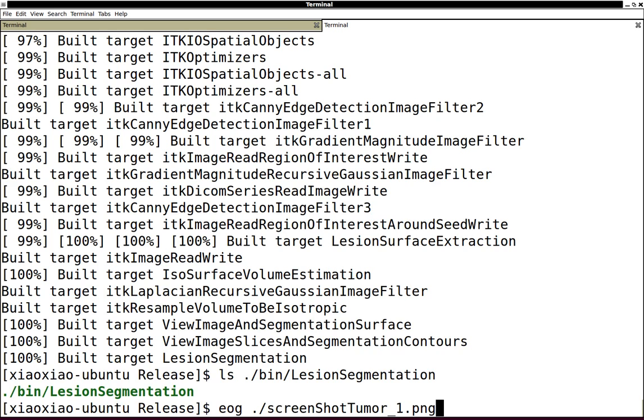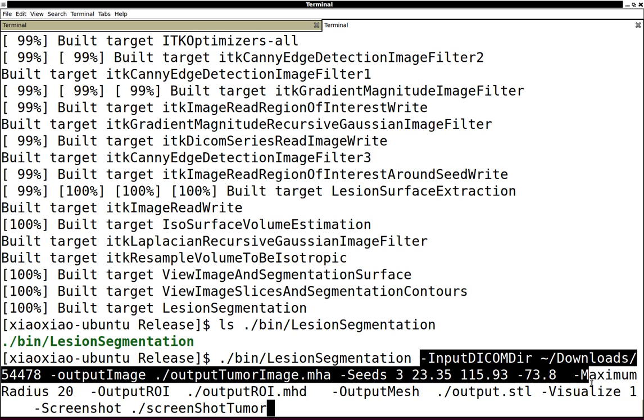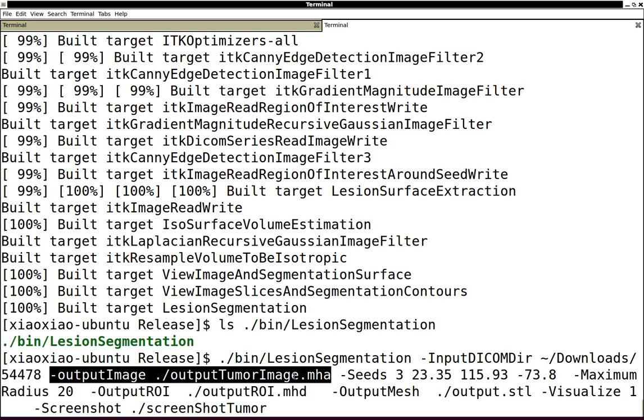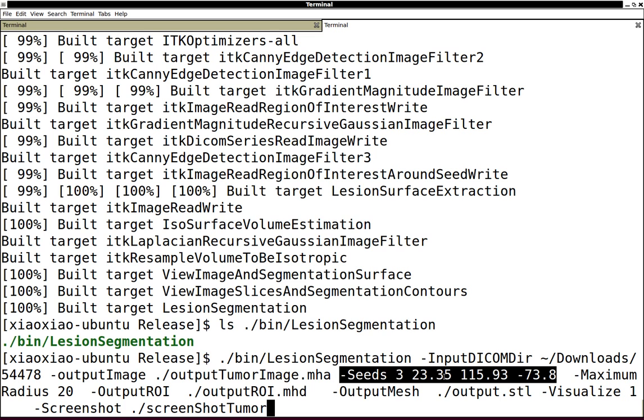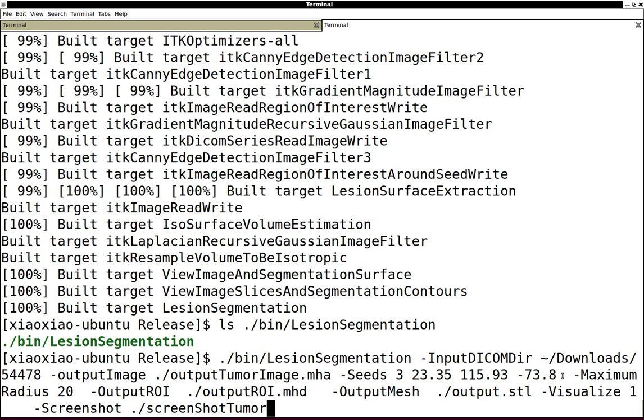After you download the data, specify the path to your image and then specify the segmented output image. Then put your seeds here. This is XYZ physical coordinates of the lesion, so basically just pick a point in that region.